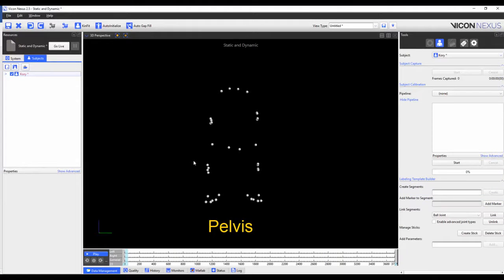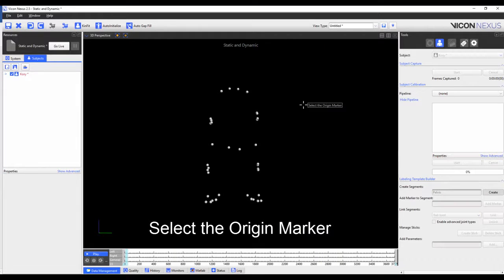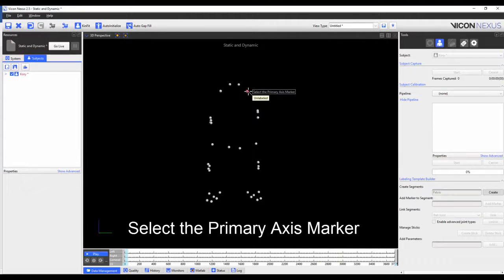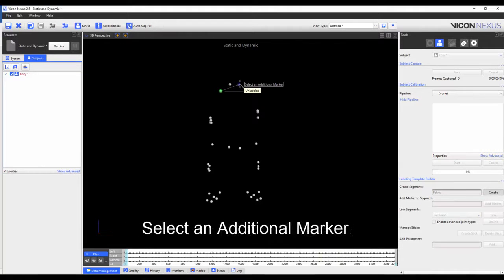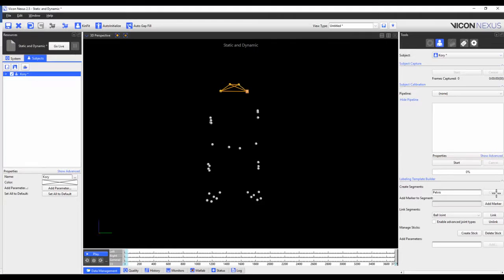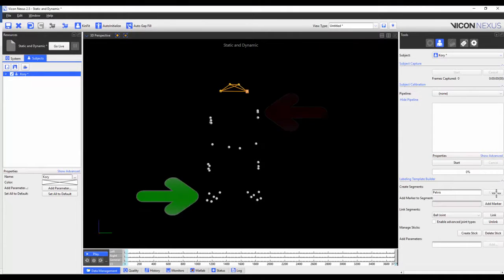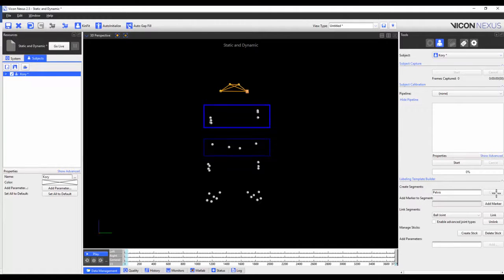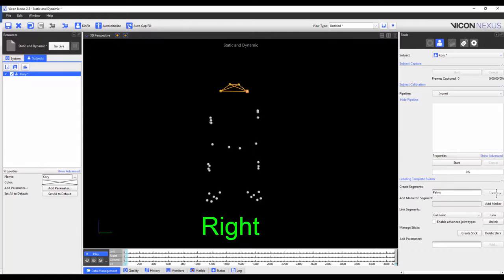I'm going to create the pelvis segment first. After I type the title in and press Create, it will prompt me to select the origin marker, then the primary axis marker, the secondary axis marker, and more additional markers. When I've chosen all four, I'm going to press Create again. I'm going to continue the process with the remaining segments, starting with the left thigh segment all the way down to the right foot. I'm also going to be placing the knee markers in the thigh segments and the ankle markers in the tibia segments. You'll also notice that when I'm typing the segment name, I'm including the word left or right as well as the segment name, all one word — for example, left thigh.